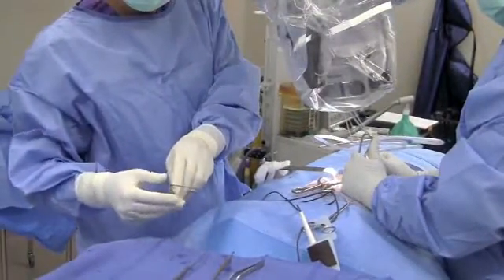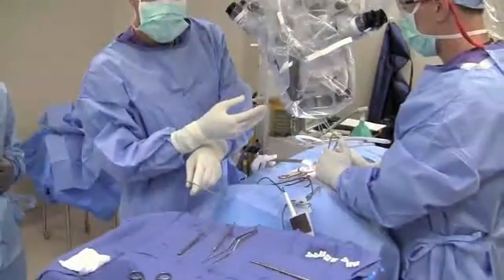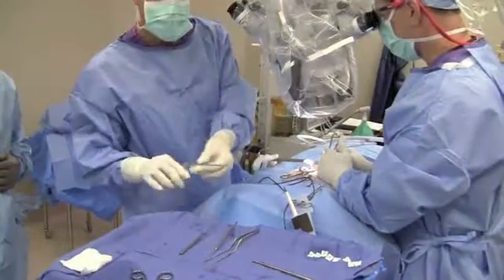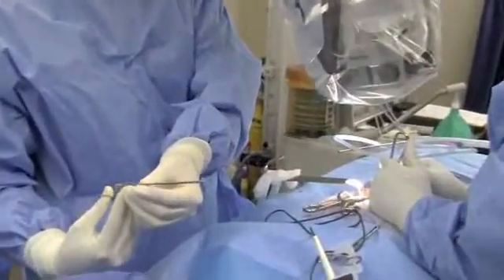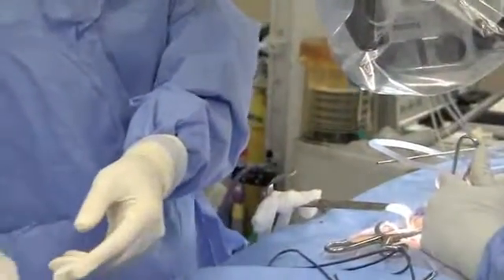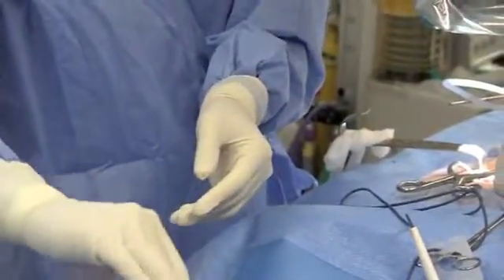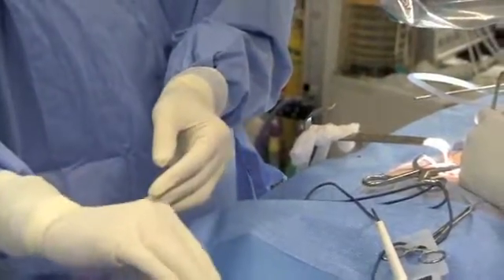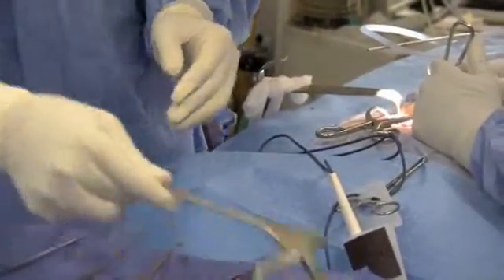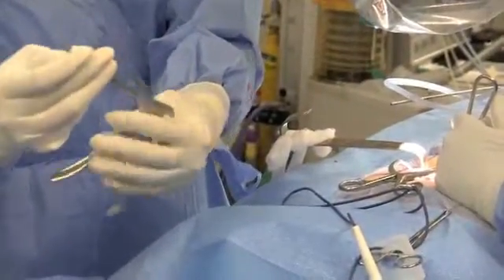Here we are in surgery. I want to show you some instruments that we use — we're about 35 minutes in. This is a small micro pituitary that we use to grab tissue underneath a microscope. This is a micro nerve hook that we use to move things around carefully. And this is a small ball hook that's similar to that for moving tissue. This instrument is called a Kerrison and this also grabs and removes bone.